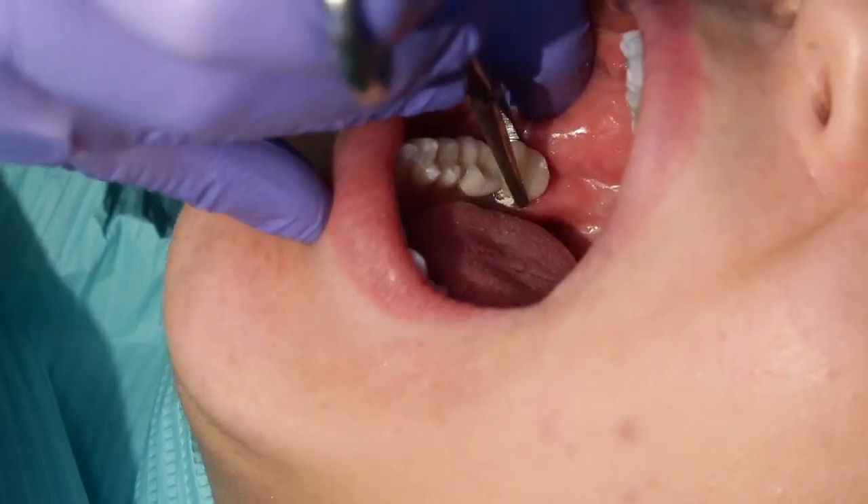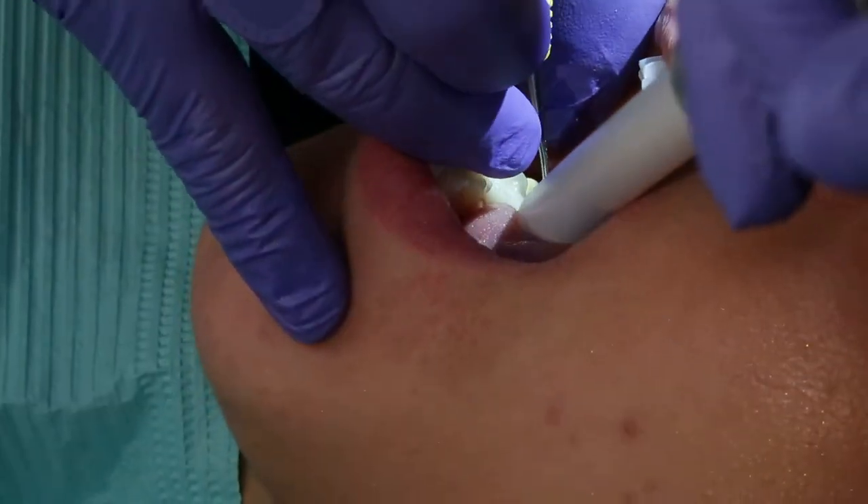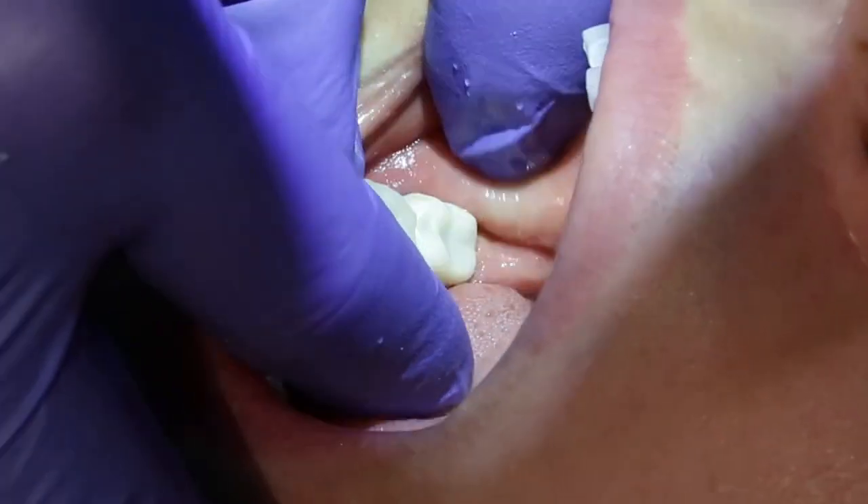When the patient returns to receive their final crown, remove the provisional and clean the tooth surface of any residual cement. Try in the crown and make any adjustments needed.